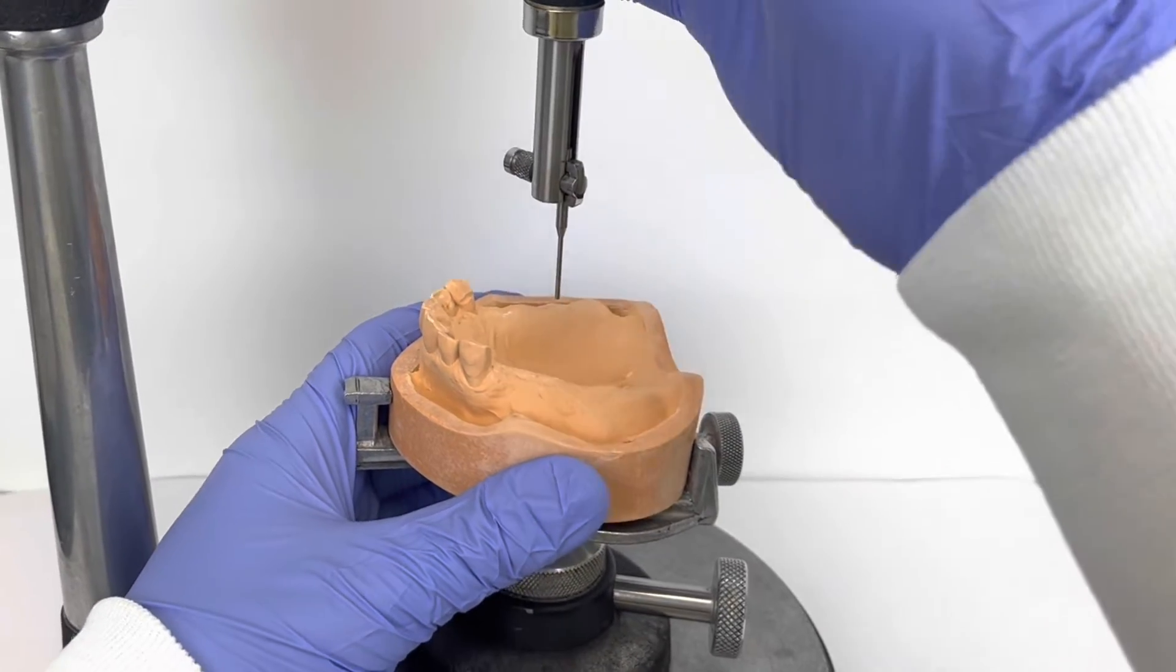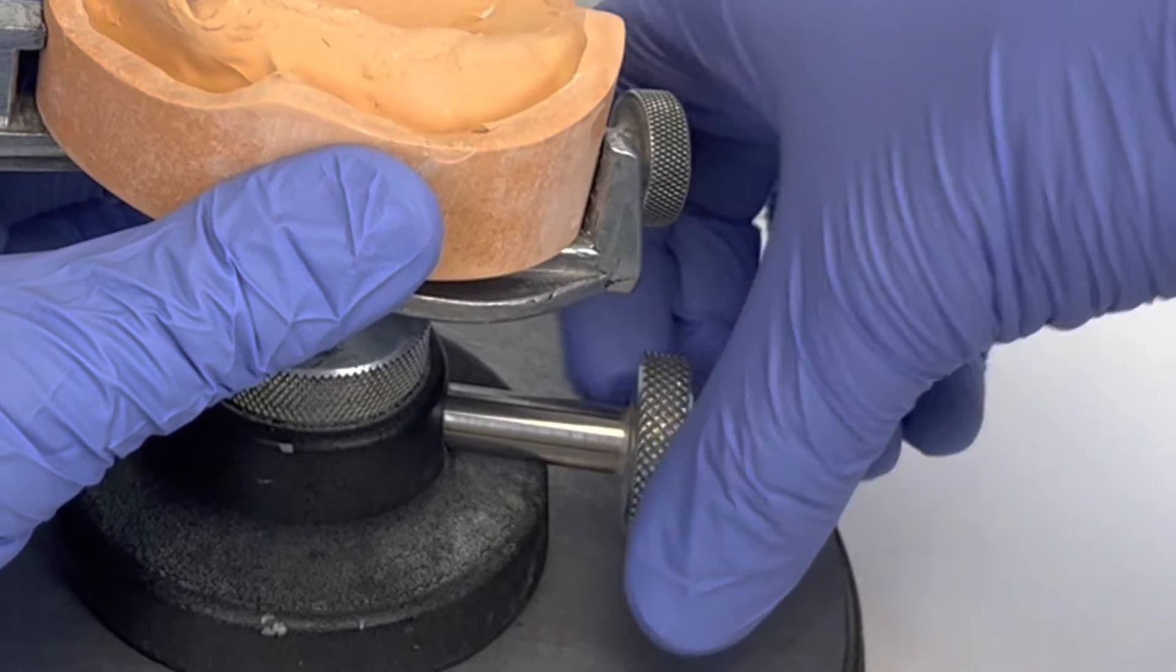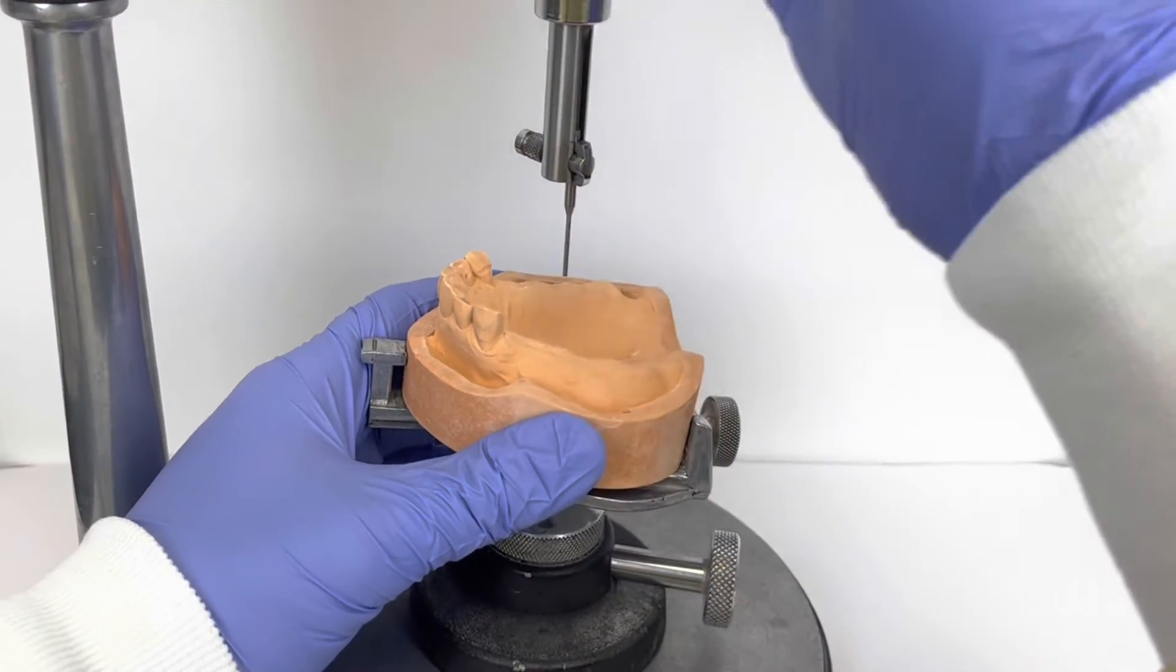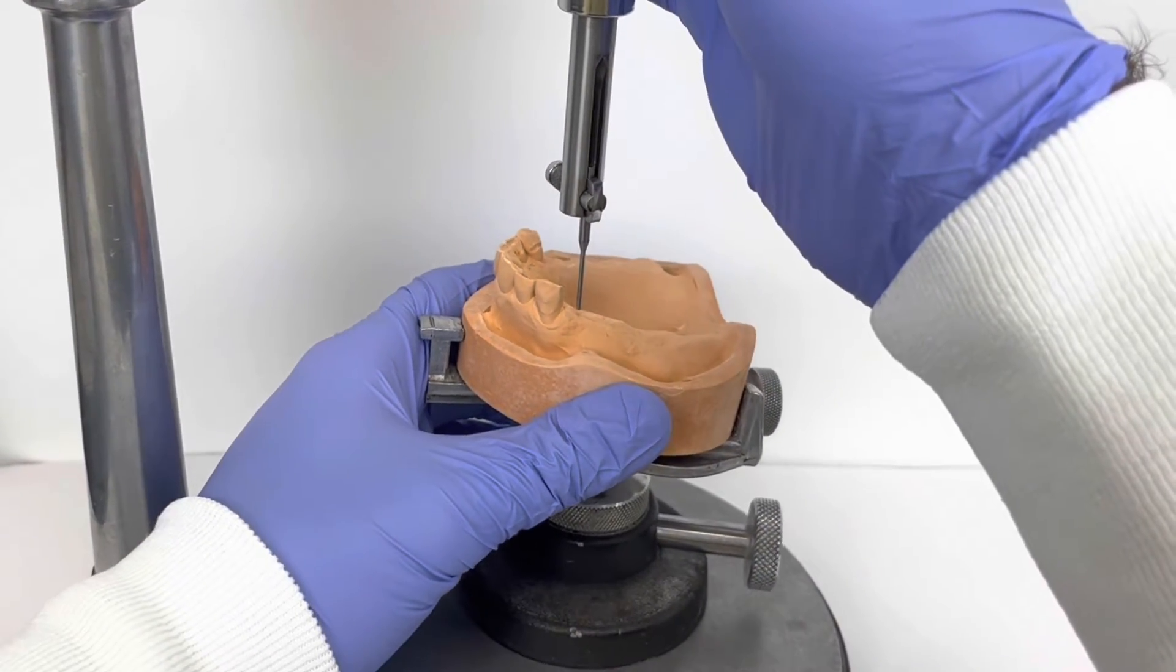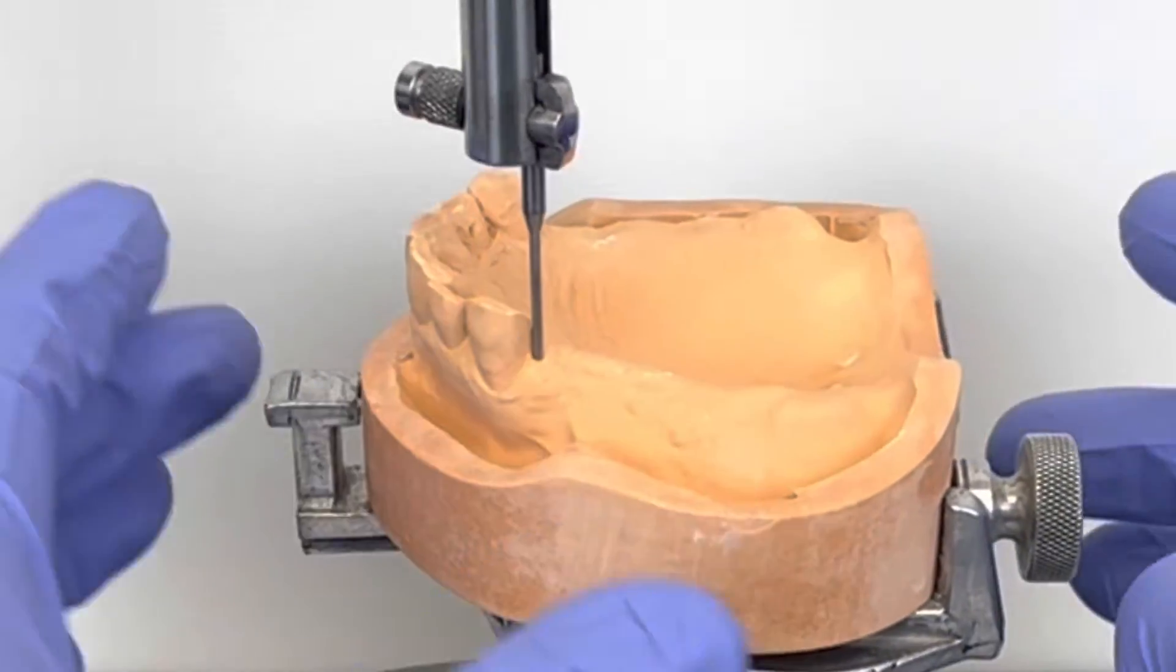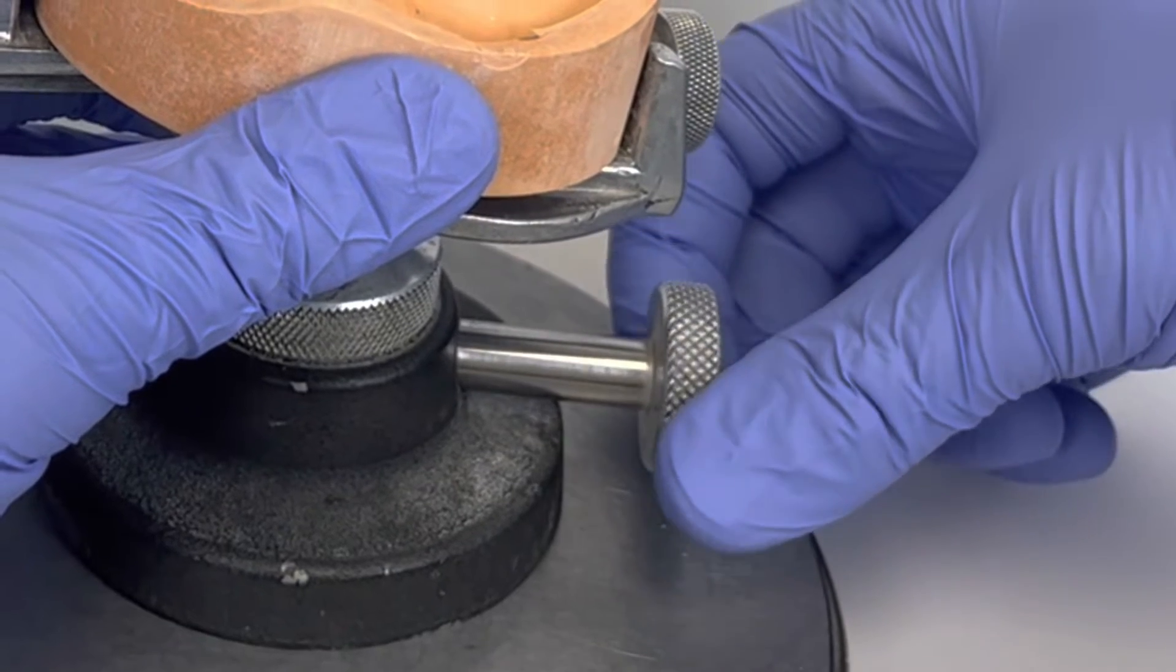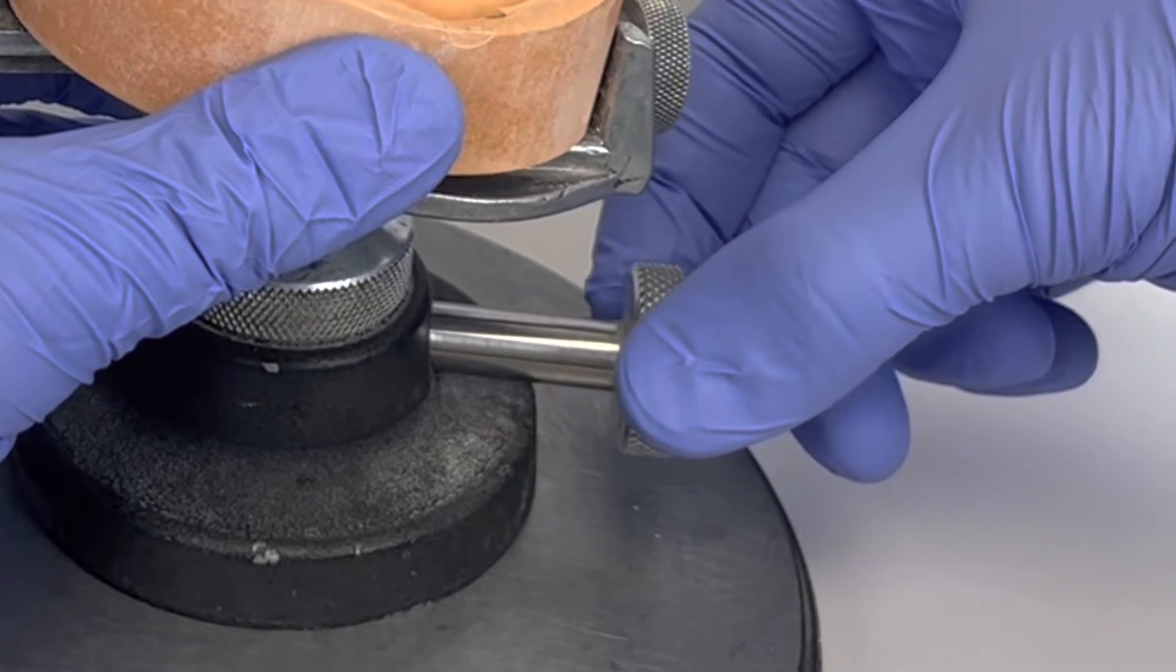With the analyzing rod placed in the surveyor, the hinge is loosened to allow for free movement of the table. The cast is now angled to allow the analyzing rod to fit against the side of the tooth as close as possible. Once an acceptable angle is reached, the hinge is tightened to stabilize the table in position.